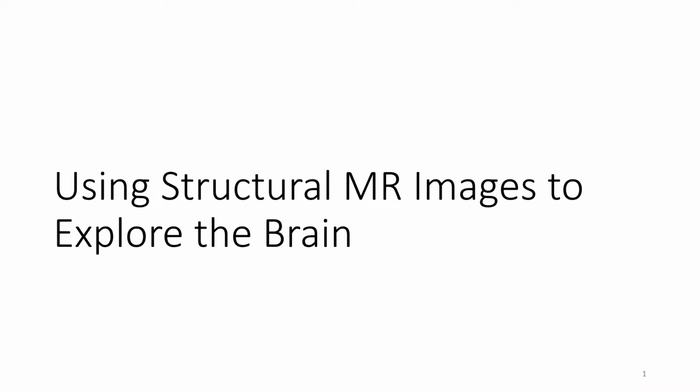Hello and welcome. The purpose of this lecture is to focus a little more on MRI to help prepare you for the activities in this module.